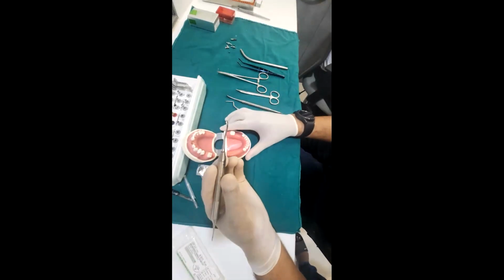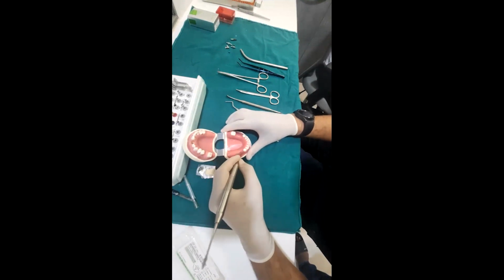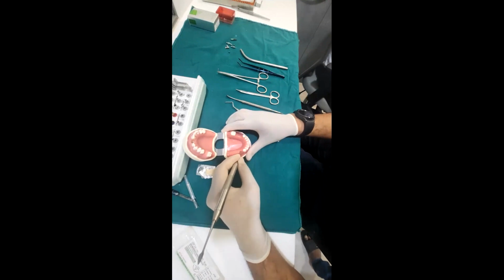You can use a soft periosteal elevator and ensure that you reflect a full flap till you see a full, complete, clean bone surface. There should not be any tissue tags as far as possible.